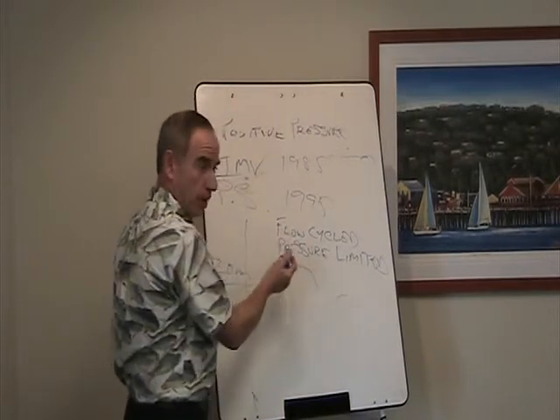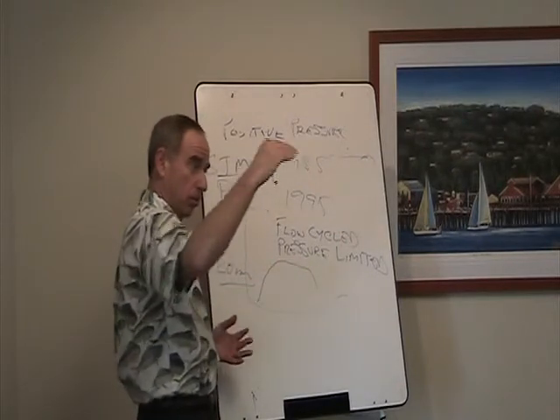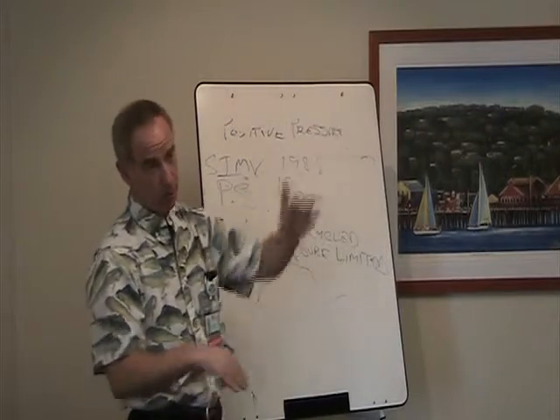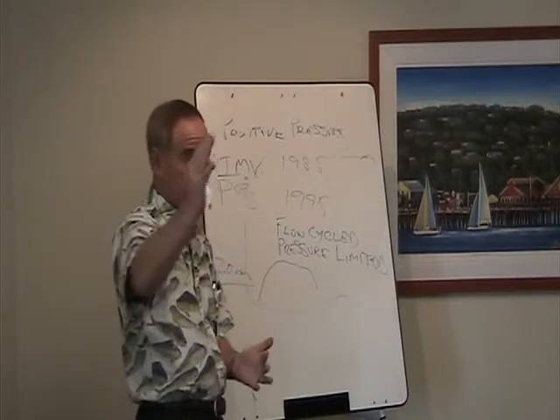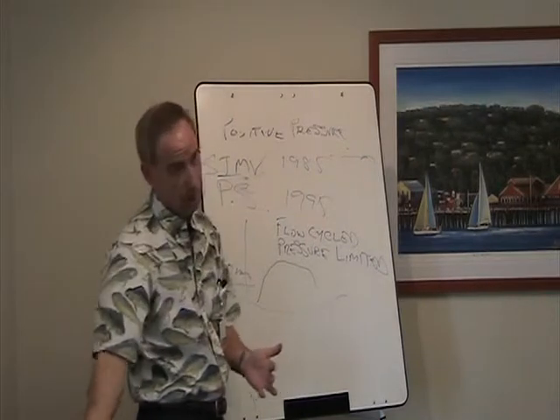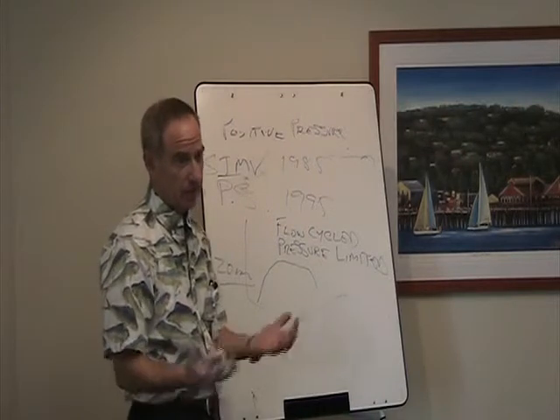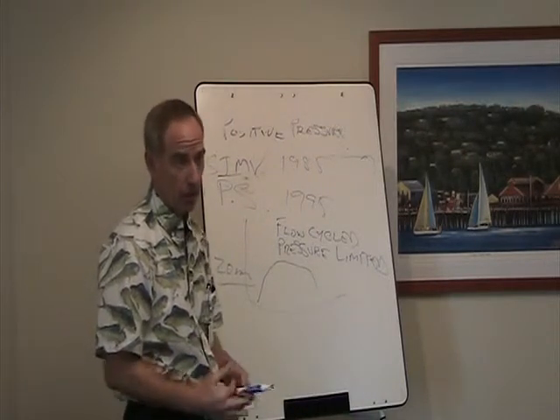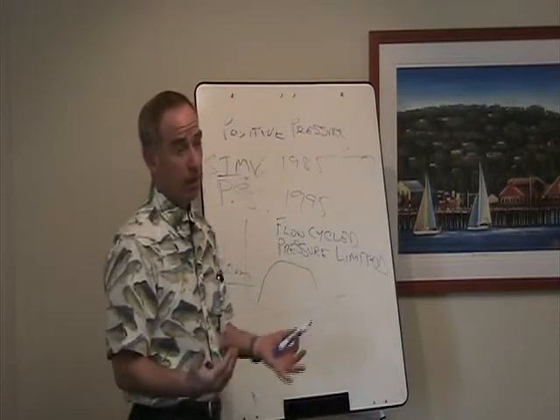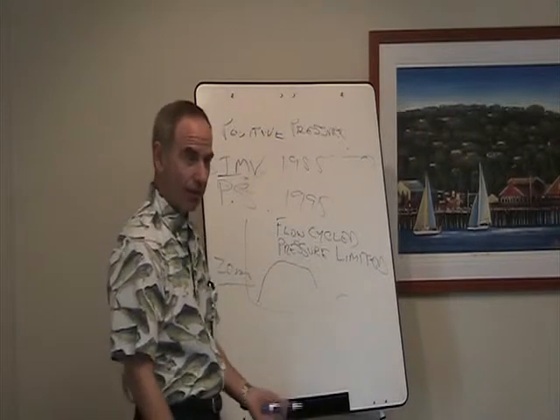In this mode of ventilation, it's the same thing. As it gets close to zero in the flow rate, or 25% of the initial very fast flow, the ventilator releases and allows the patient to exhale. So that's why it's called flow cycled, because it's actually sensing the flow from the ventilator to the patient. And if the patient is taking a really big breath in, they're going to get more air, and if they are not, they're going to get less air.